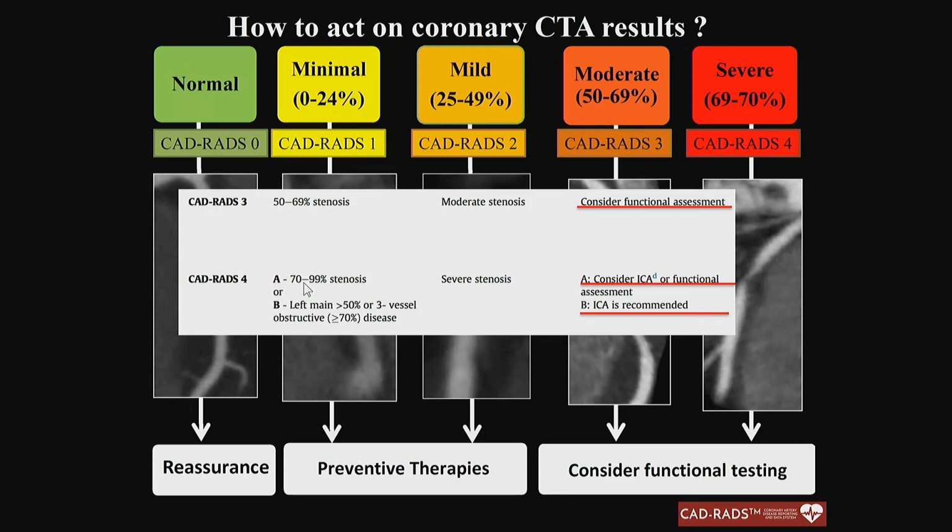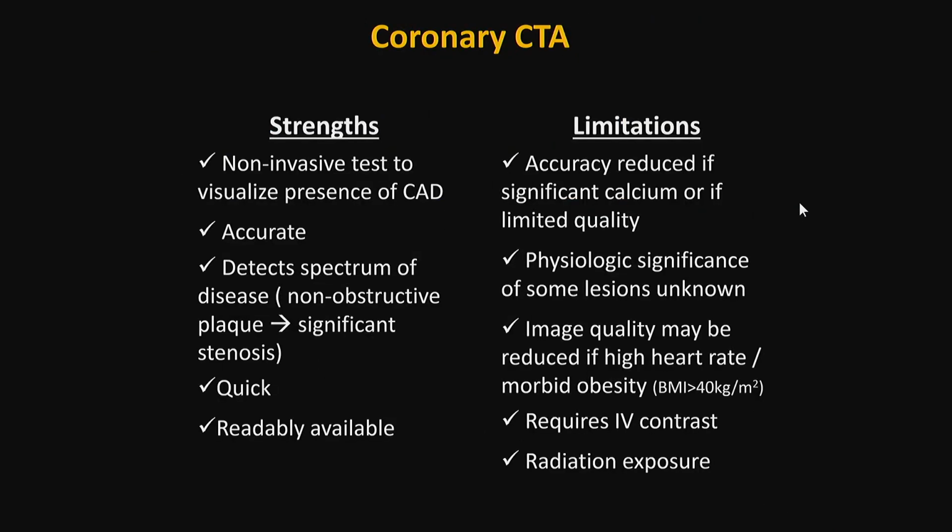And in fact, most patients with severe stenosis could have either an invasive angiogram or functional assessment. So perhaps the most important take-home point from this slide is that non-obstructive disease warrants preventive therapies. Moderate stenosis, 50 to 69%, warrants functional assessment, not invasive angiography.